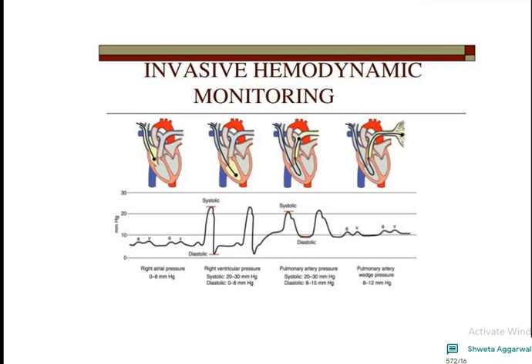But if there is a VT, then you know that this is not correct and you have to withdraw it. After that, when the catheter enters the pulmonary artery, the waves will not be peaked, there will be smoothing of the peak, and you can calculate pulmonary artery pressure.